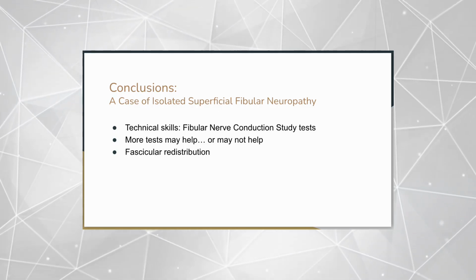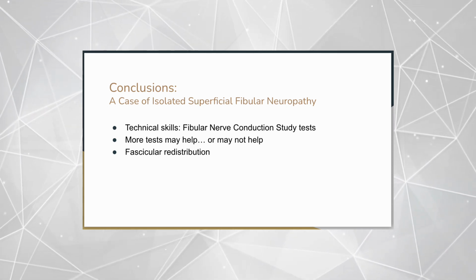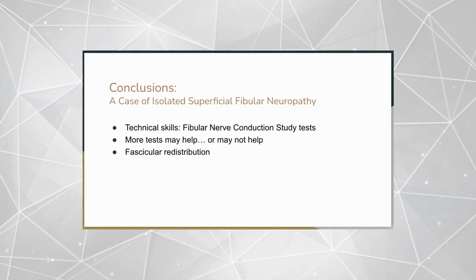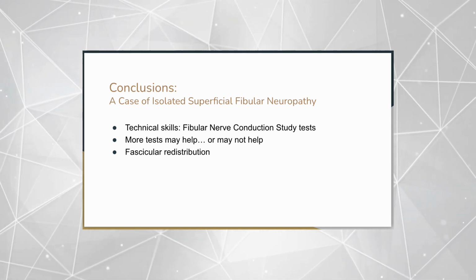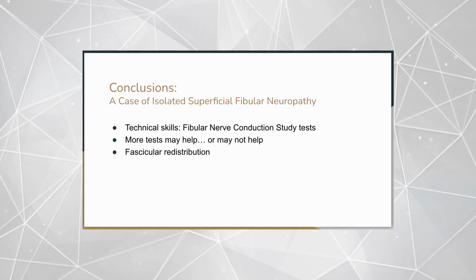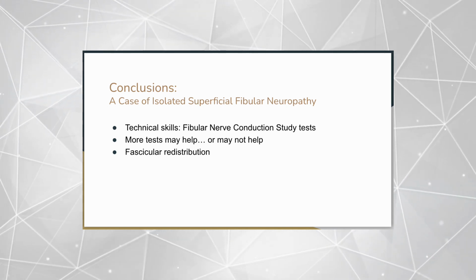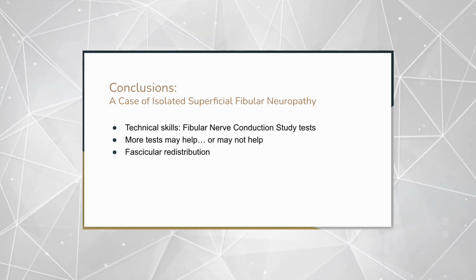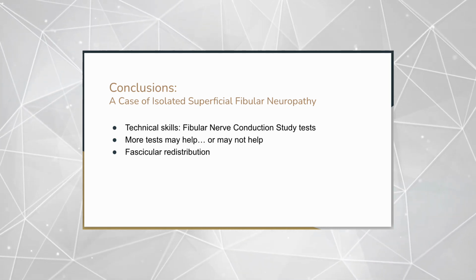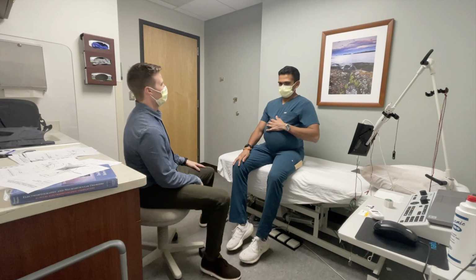There are a few things that I learned in particular from this case. First, I gained a better understanding of how to technically perform multiple fibular nerve conduction study tests. Secondly, this case shows that more tests may be beneficial to a patient's electrodiagnostic workup. On the contrary, it's important to recognize that more nerve conduction study tests would be painful for patients and would cost providers more time to complete testing and may not also provide more information to physicians and patients, depending on the case. Additionally, fascicular redistribution may explain differences in motor and sensory studies in specific cases of conduction block.